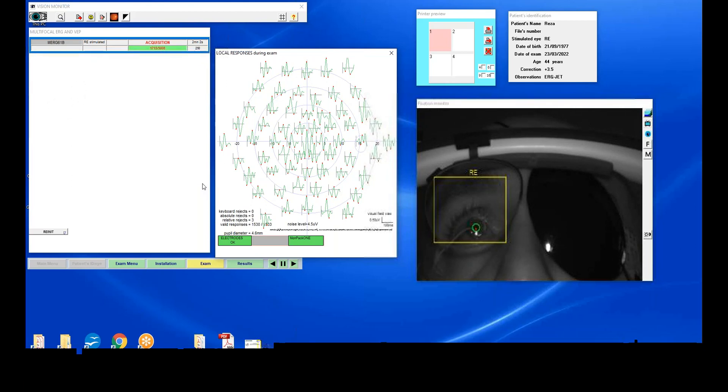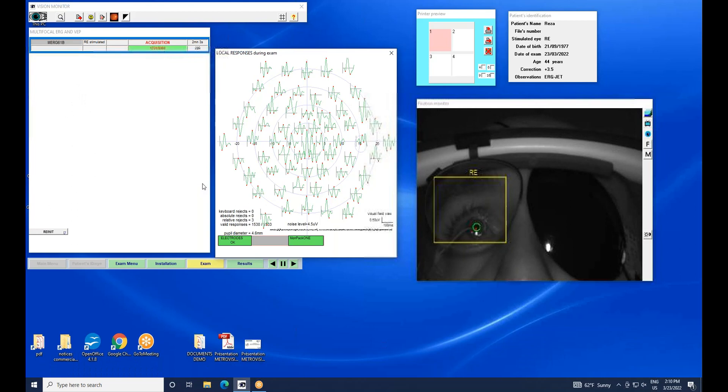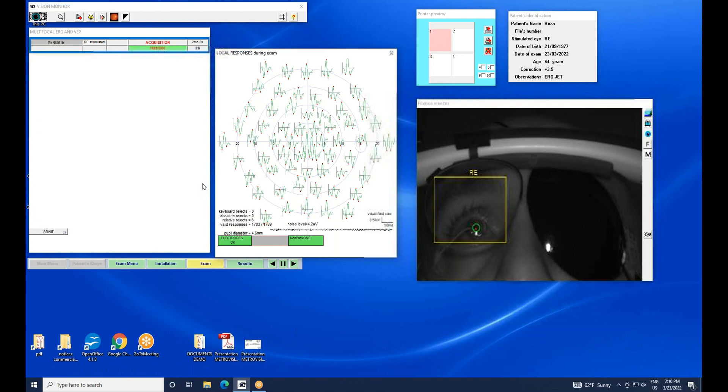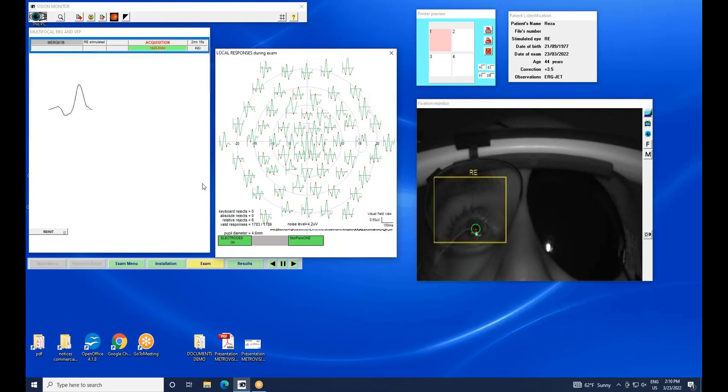In this case, I can press the result button and perform the analysis of the results. However, if I'm dealing with a subject who blinks or makes eye movements, I will certainly need more time to reach an acceptable level of noise. Thank you very much.